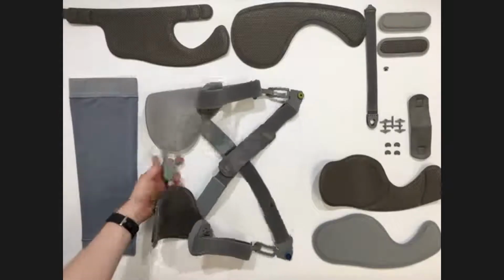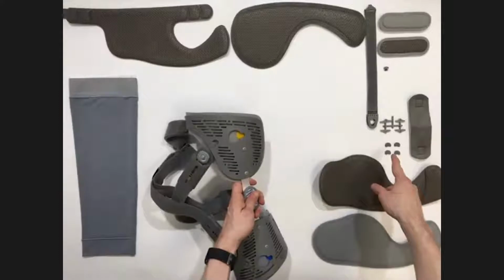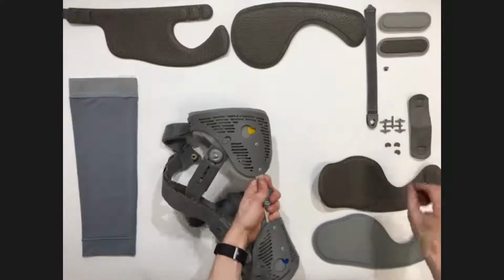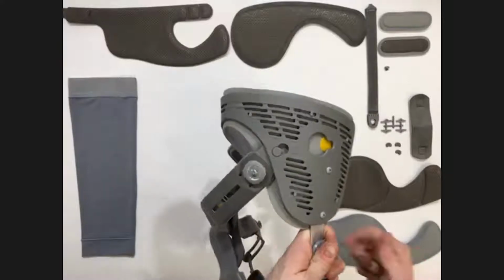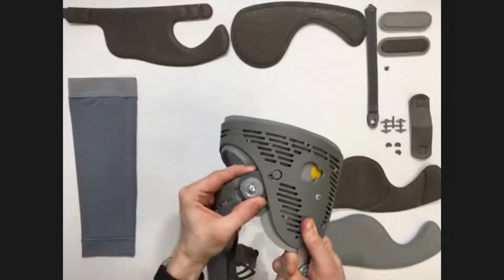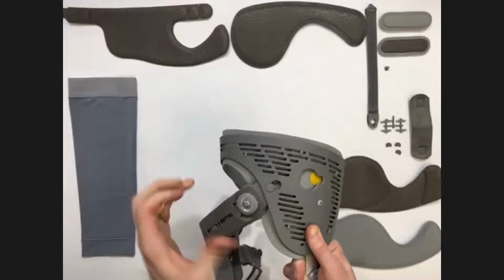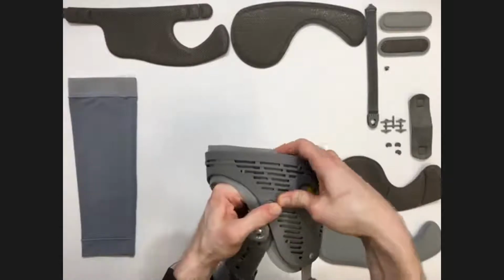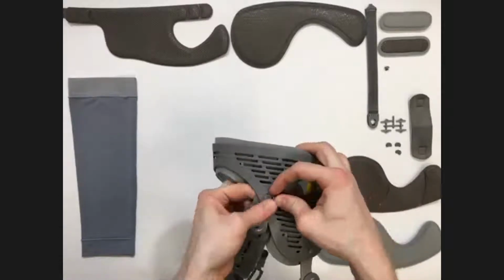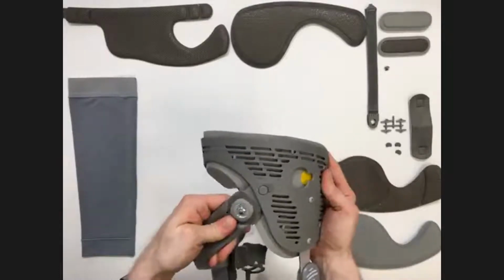There are also these half moon shaped pads here, and what these ones are for is if you've got a patient that you're concerned is going to tamper with or undo the straps. You can see that these would come unclipped if they wanted to mess with those. You can actually place those in, and it stops the patient from being able to modify the strap configuration. So you just pop that in, and you can see that it prevents that from being removed.